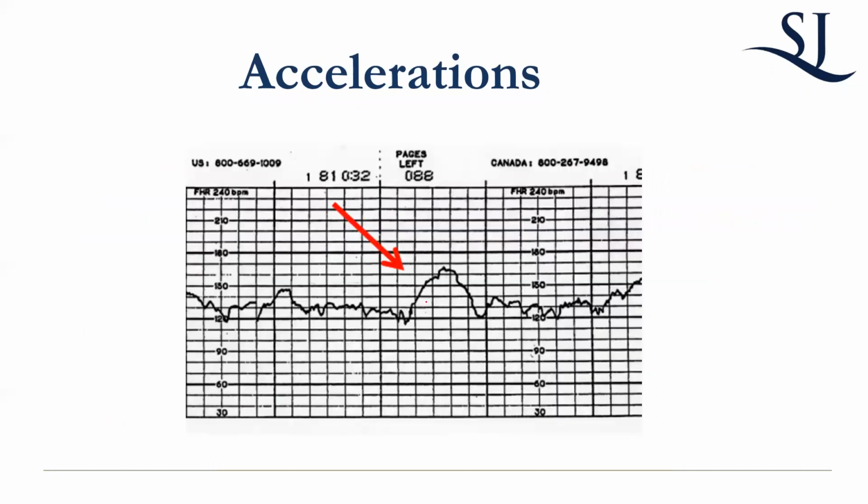So an acceleration looks like you have your sort of baseline here, right? So you have this. Now they're not including this, so I'm assuming the patient's above 32 weeks gestational age. And then you have this bump here. Okay, then it goes back, right? And it looks like another one is starting. That's it, just like this. And then your baseline resumes.